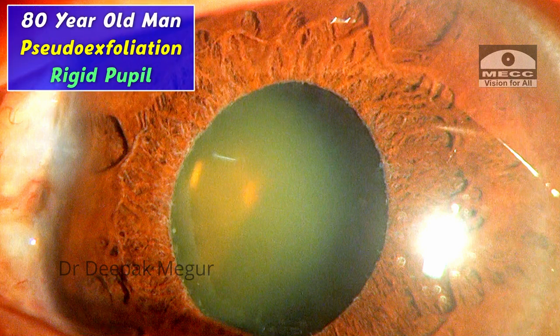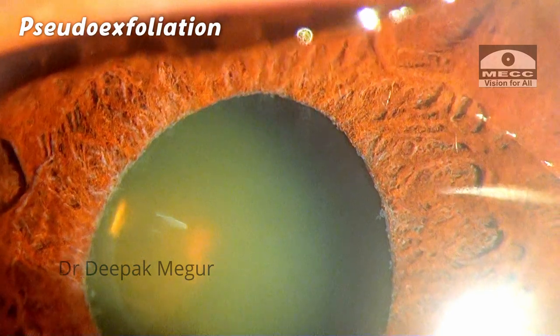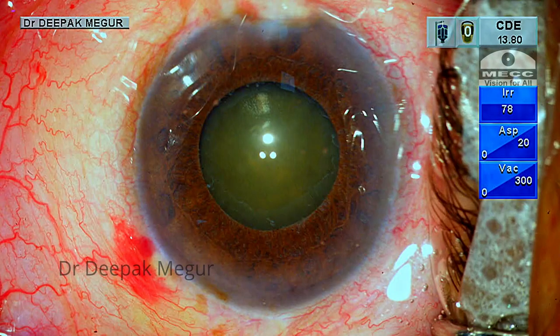This is an 80-year-old gentleman who has pseudo-exfoliation with a moderately dilating pupil. He has classical sphincter atrophy, a rigid pupil, and is posted for cataract surgery. I have prepared myself for dealing with diffuse zonular weakness secondary to pseudo-exfoliation in this patient.